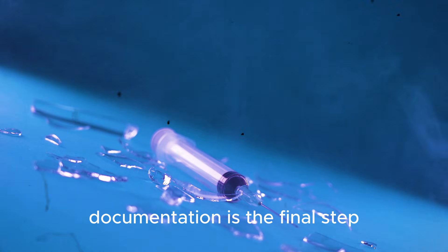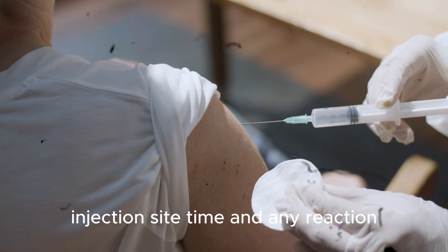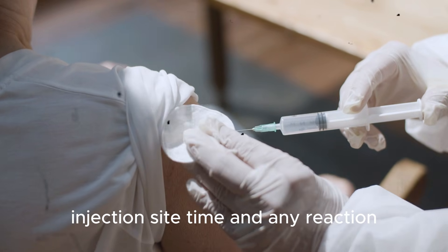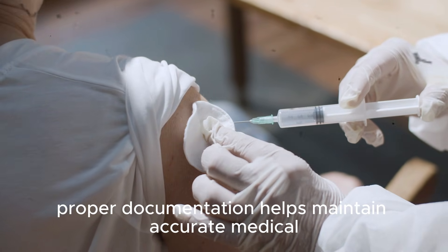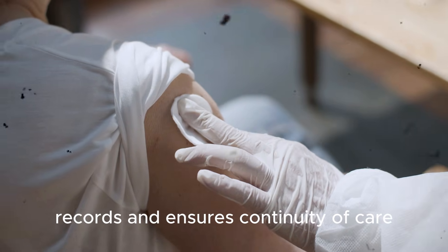Documentation is the final step. Record the medication name, dose, injection site, time, and any reaction. Proper documentation helps maintain accurate medical records and ensures continuity of care.